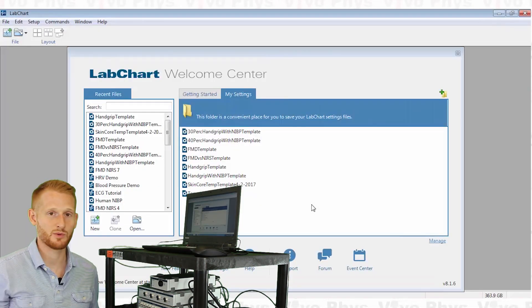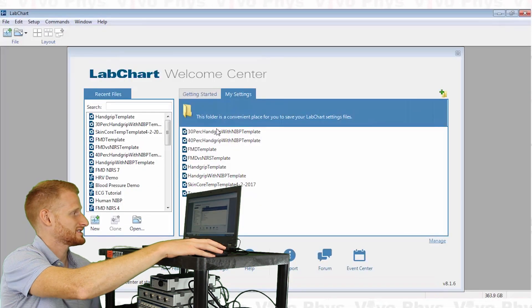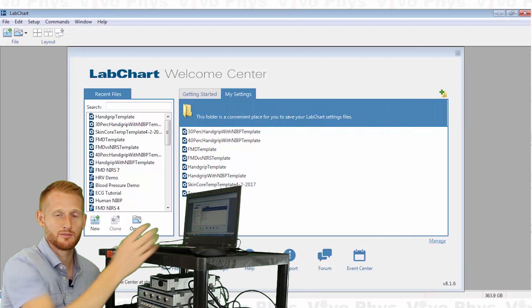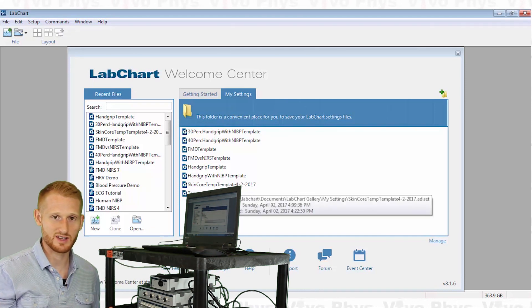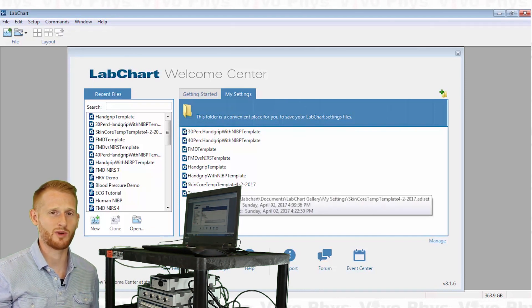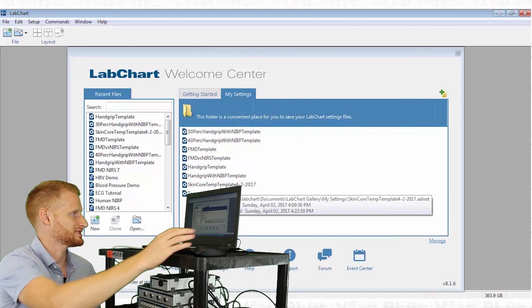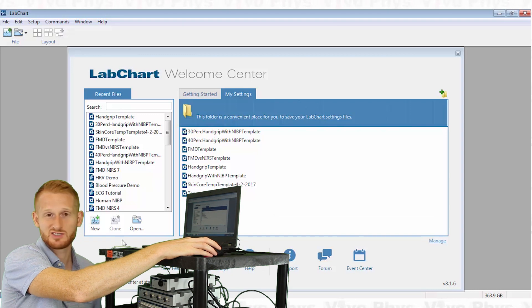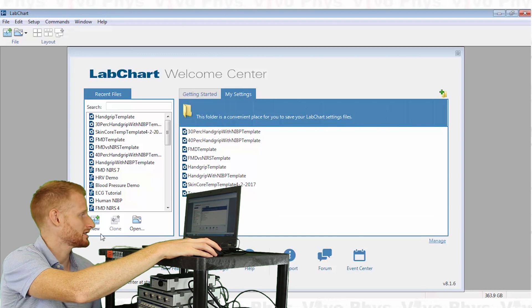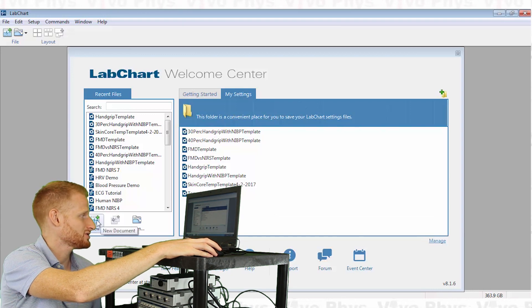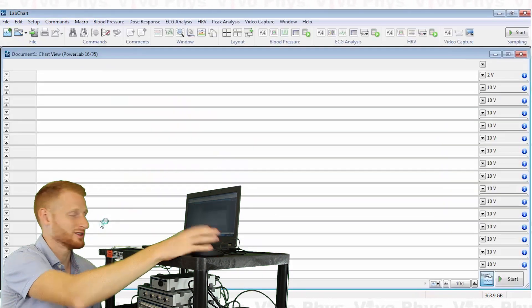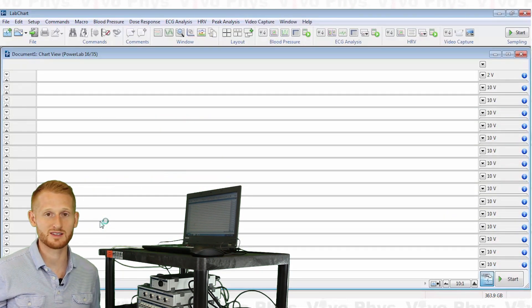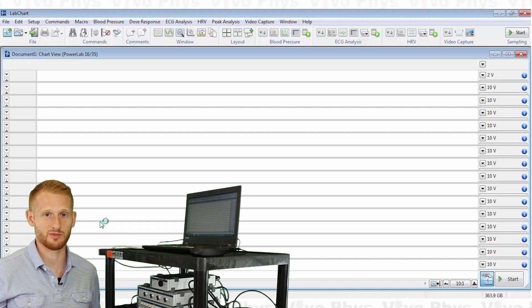Alright, so here we have our different settings files. You could build this into a settings file, but at the moment I don't have this built in, so let's go over here and click on 'new', which is going to open a new document with no previous settings programmed into it.